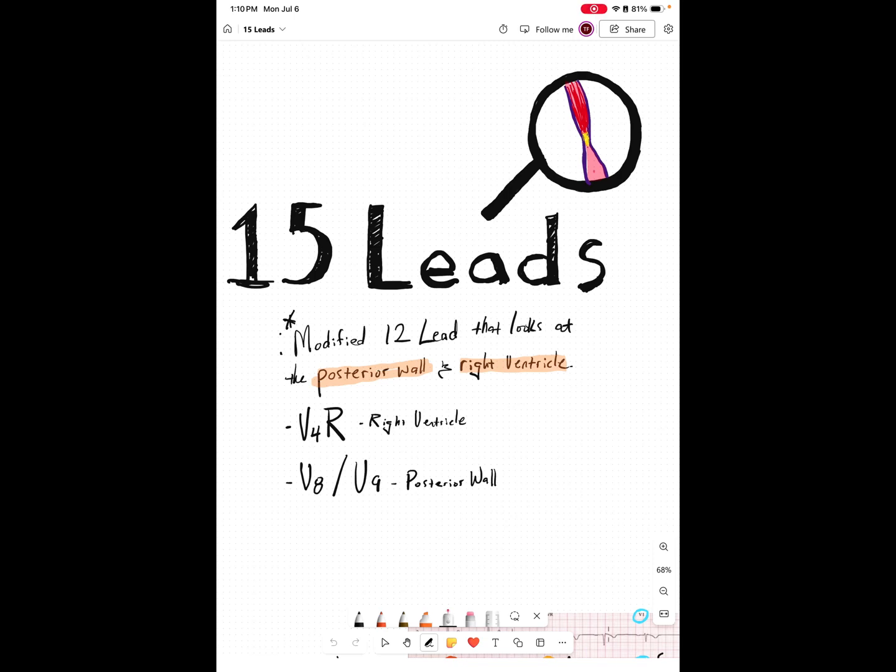Hello, welcome to this video where we are breaking down the 15 lead. What's a 15 lead? Why is it warranted? And isn't a 12 lead good enough?